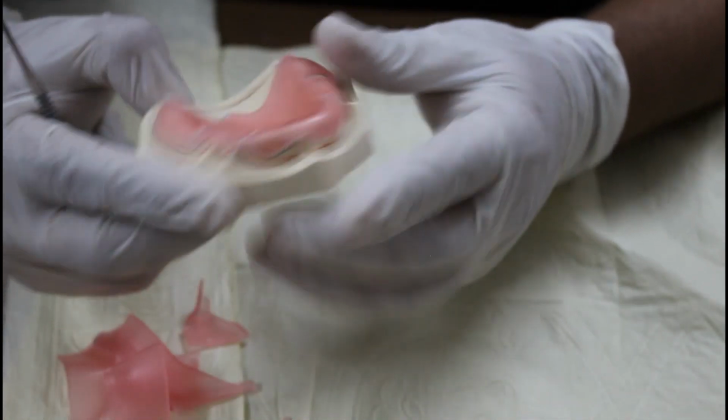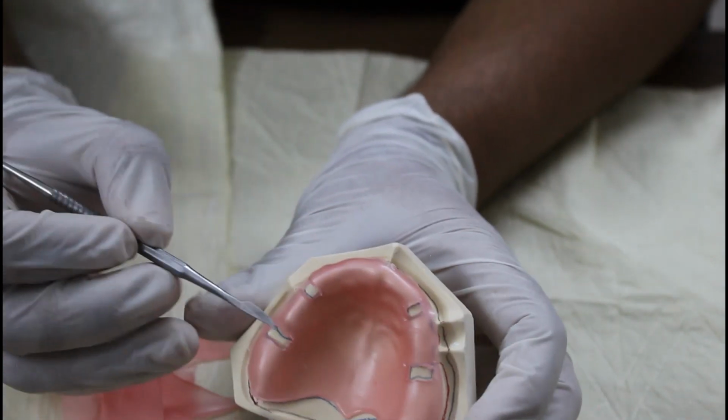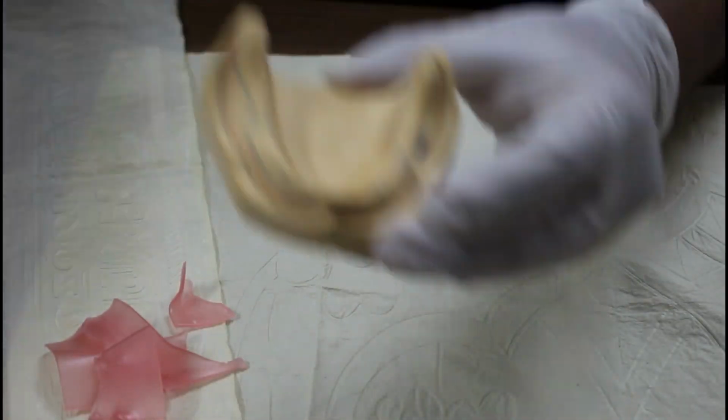Okay, so we have your wax spacer till the blue color line. We have 4 tissue stops. This is a wax spacer. Same way you have to do it for the mandibular cast.